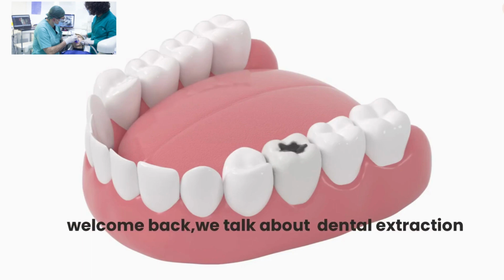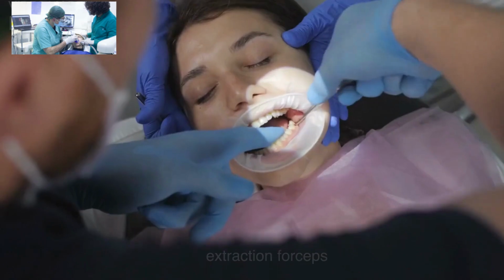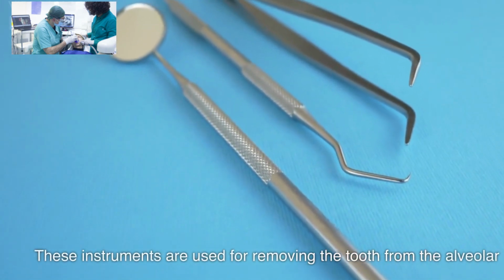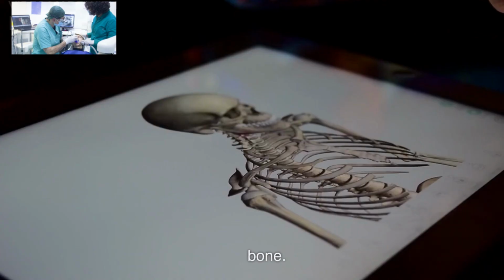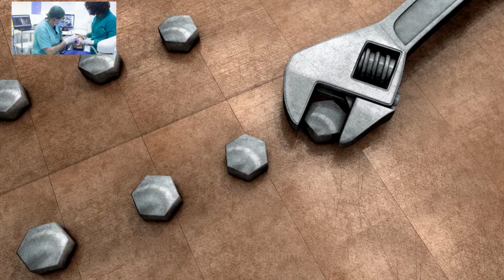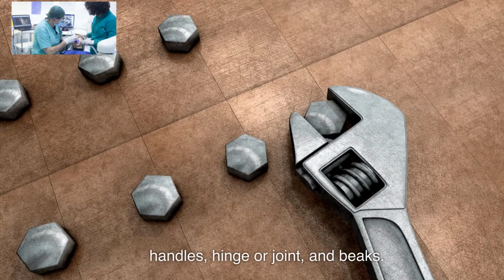Welcome back. We talk about dental extraction. Extraction forceps. These instruments are used for removing the tooth from the alveolar bone. The basic components of dental extraction forceps are the handles, hinge or joint, and beaks.